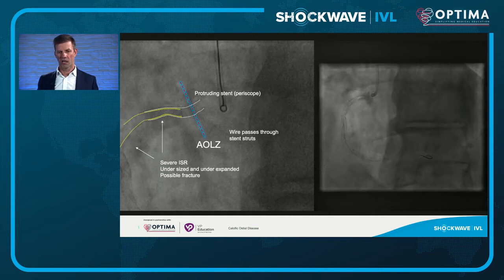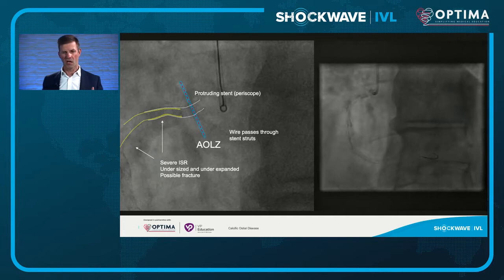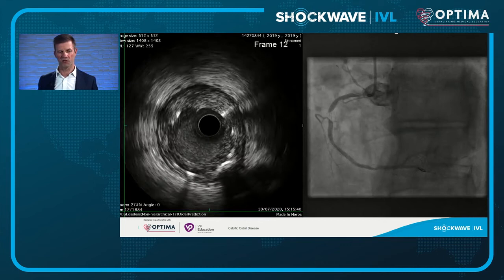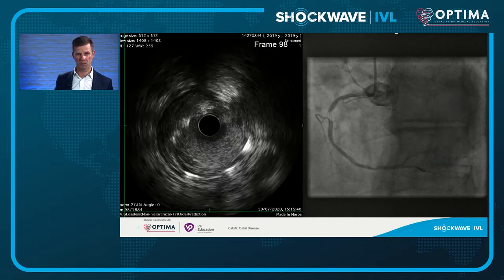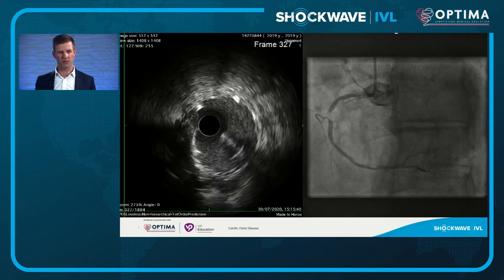On angiographic imaging, we see not only aorto-osteal target lesion failure but also restenosis in the mid vessel at another position of stent overlap — with probable stent fracture there. Intravascular imaging determines the mode of failure, showing stent under-expansion: a small stent in a large vessel. Working further back up the artery, at the stent overlap there is a lot of movement and suspicion of stent fracture on IVUS imaging.